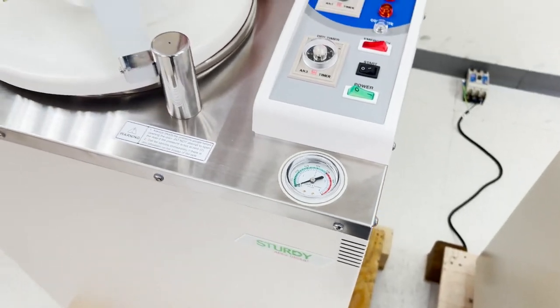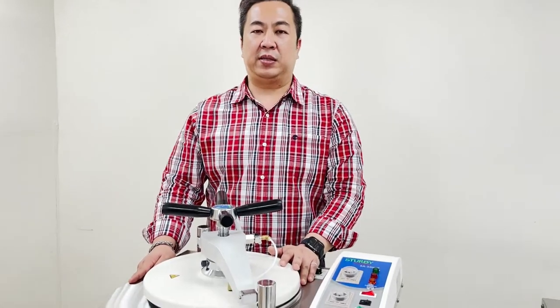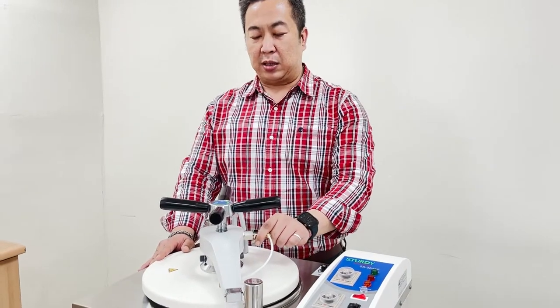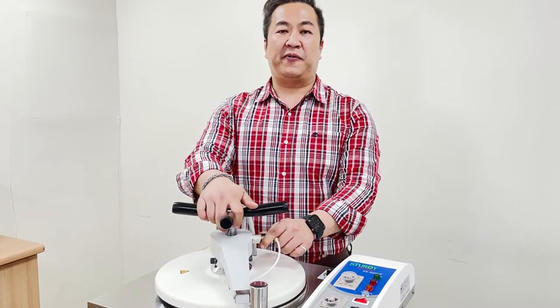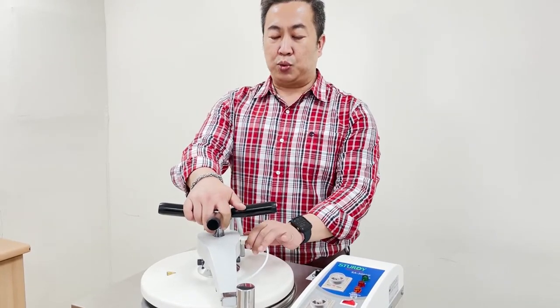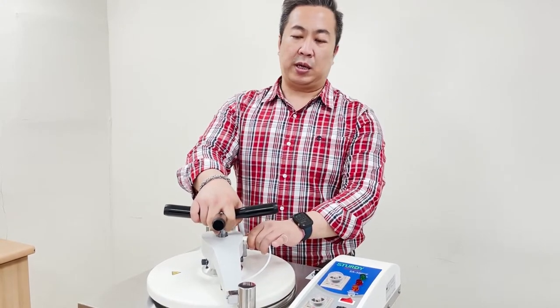Moving on to the safety feature, the vertical autoclave comes with pressure overload and overheating safety mechanisms. There is a pressure safety lock located on the chamber door. In the case where the chamber is about to be opened and the pressure is not set at zero, this will automatically lock and jam the chamber door, not allowing the operator to open it.